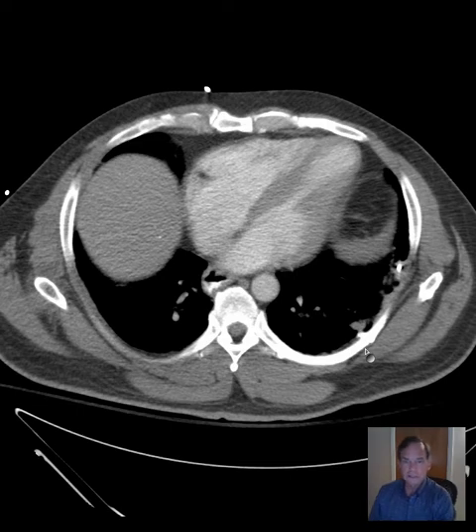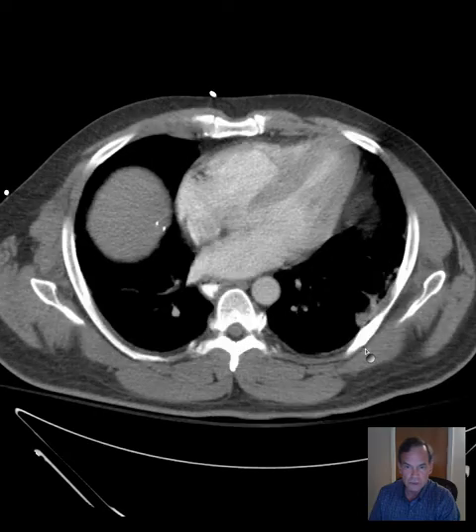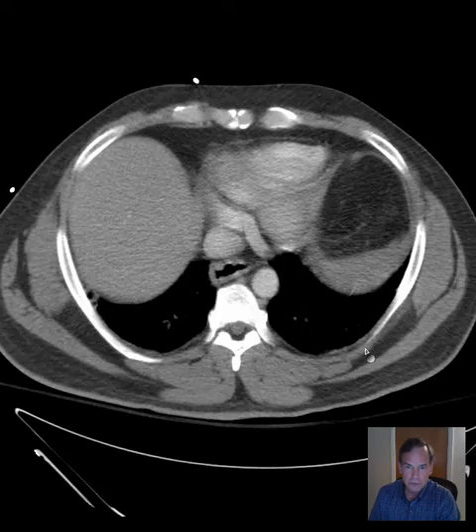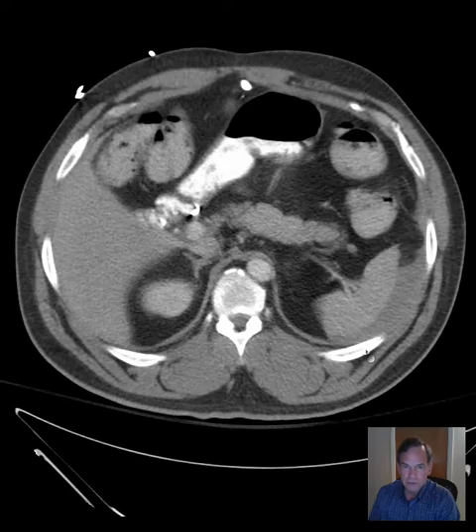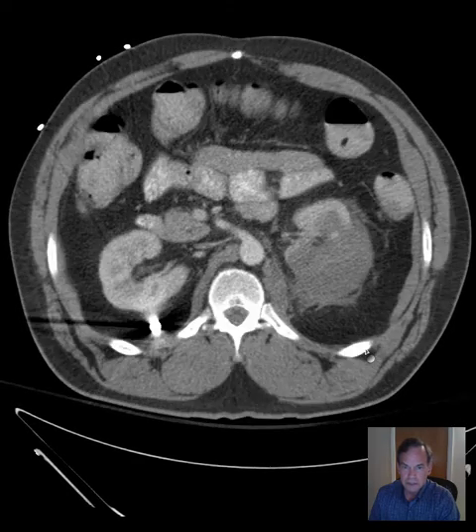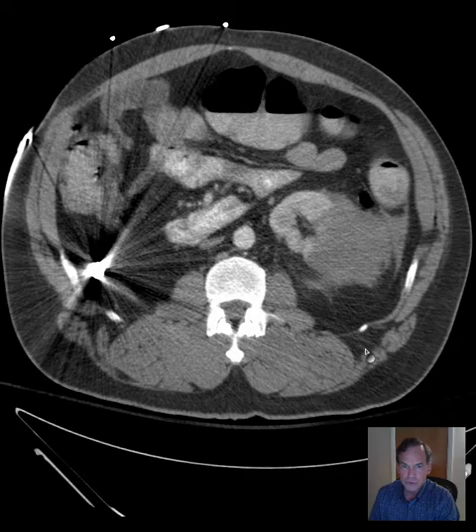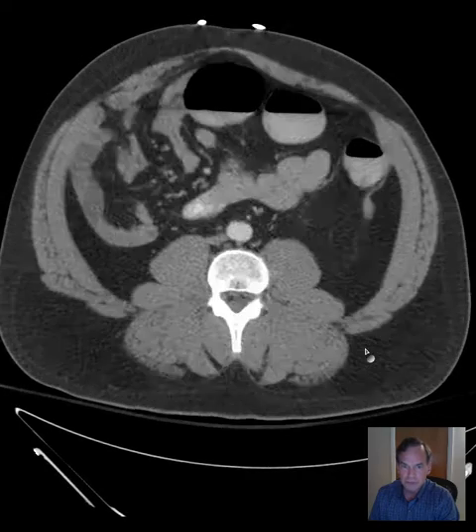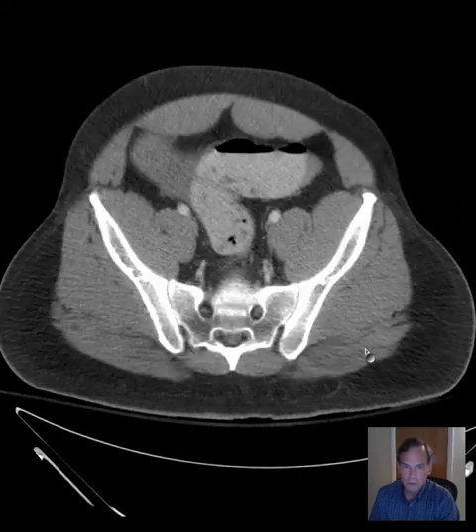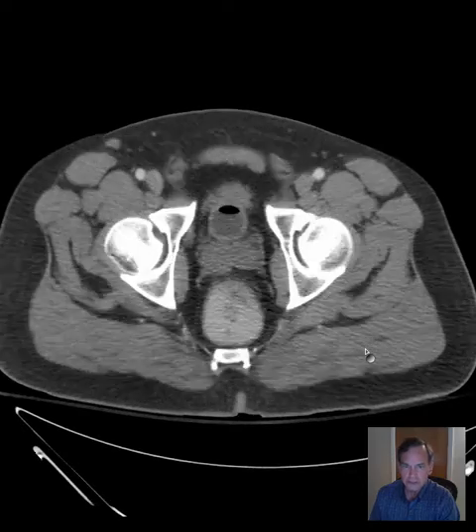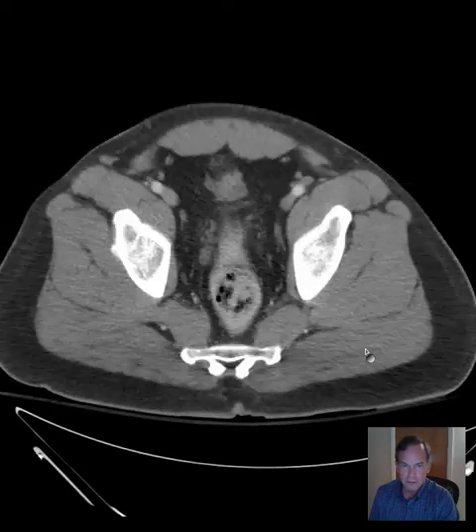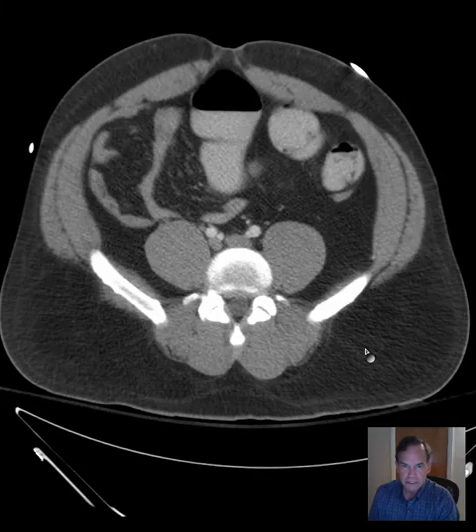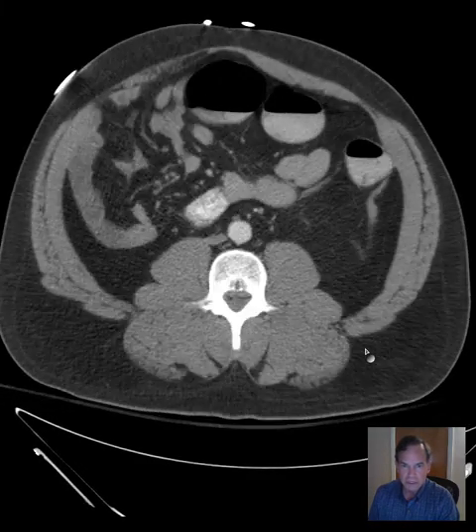Hello there, this is Dr. Mintz. This is a CT abdomen and pelvis in a patient that's recently status post gunshot wound. I'll give you a chance to look over the entirety of the images. I like to peruse the CT abdomen and pelvis from top to bottom once or twice before I start digging into the individual structures. So there we go down and then go back up and take a look and see if anything catches your eye.